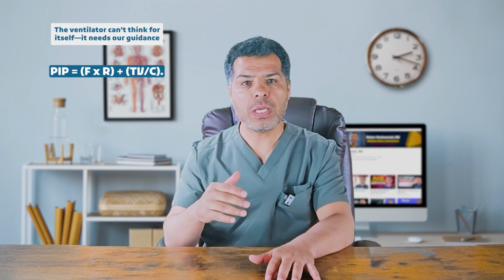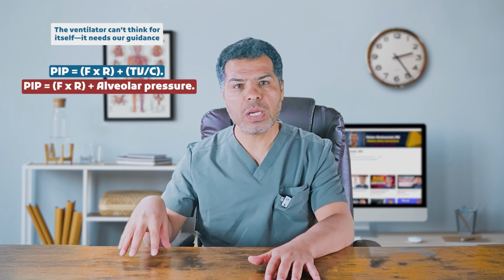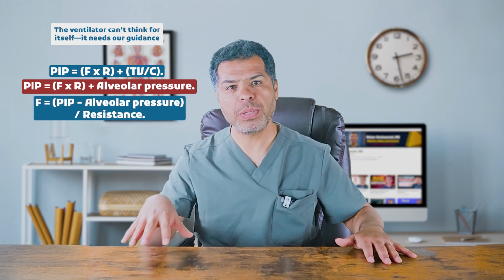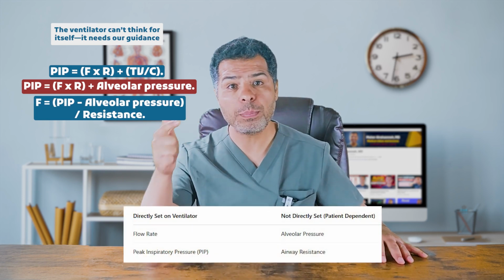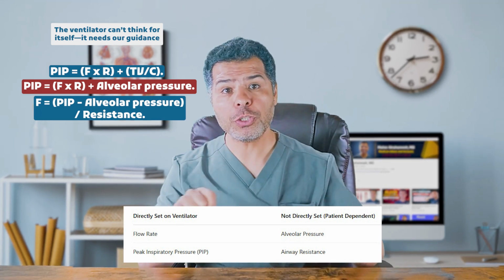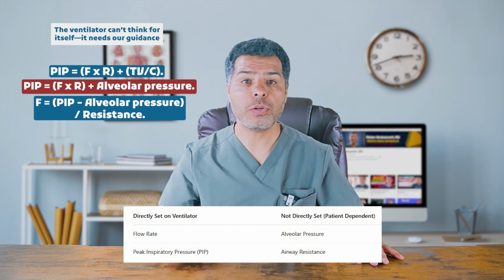Let's bring back our lovely equation again. The PIP equals flow times resistance plus tidal volume divided by compliance, which can be rewritten as PIP equals flow times resistance plus alveolar pressure, and then rearranged: flow equals PIP minus alveolar pressure divided by resistance. In mechanical ventilation, we can directly set the flow rate and the peak inspiratory pressure on the ventilator. However, alveolar pressure and airway resistance are not directly settable. They are influenced by the patient's lung mechanics and underlying conditions.